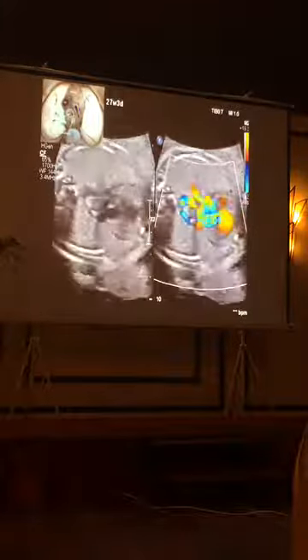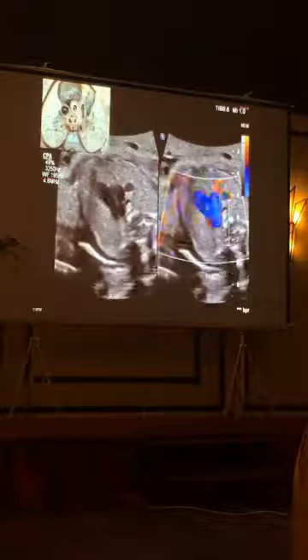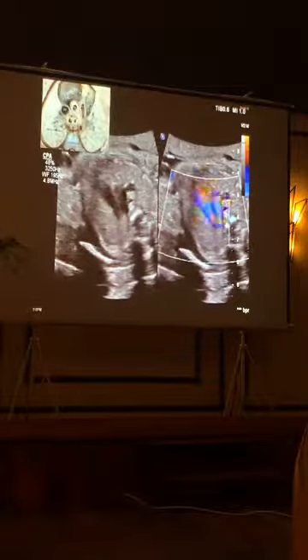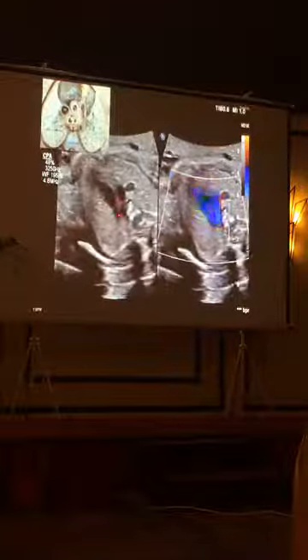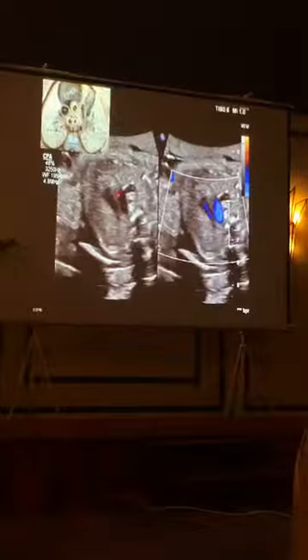And in order to get a proper image, you just have to move downward, and then you can see this very typical V. And you have to make sure that both the ductus arteriosus and the aortic arch are to the left of the mid-sagittal plane.